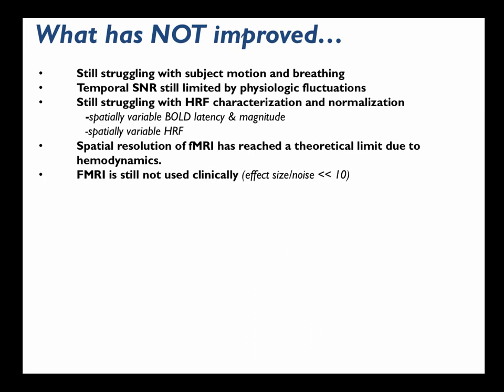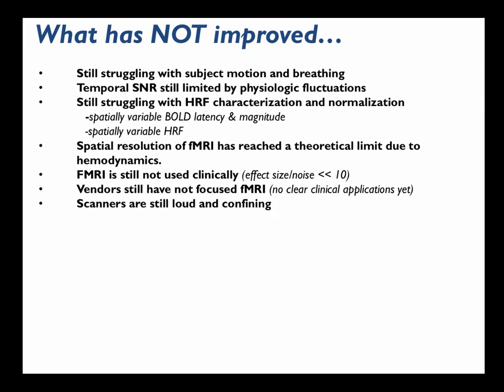fMRI is still not used clinically. The effect size to noise, at least in understanding multiple subjects, is low. Vendors still don't care about fMRI that much at all. We're actually lucky because MRI is so successful that we're sort of riding on the back of all the success that MRI has had with other applications. If MRI in general wasn't a clinically useful technique, our scanners would be 10 times more expensive, and there would be maybe 1/10 the number of people doing research on fMRI because of that. So we're lucky, but unfortunately we can't get vendors to pay more attention to fMRI.